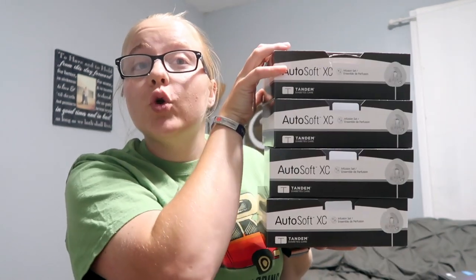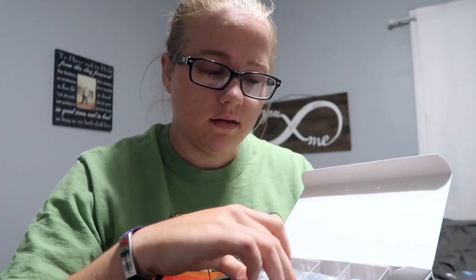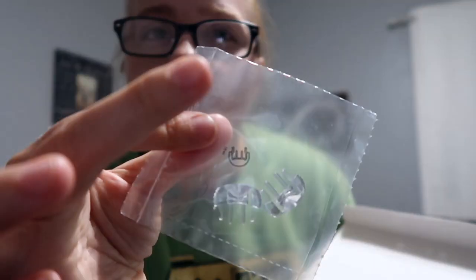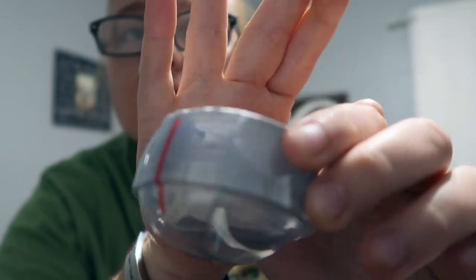This is how many infusion sets you get — it's four boxes, and each box has ten infusion sets in it. It comes with the little clips that you can put over your site if you are taking a shower or getting in the pool. I chose the Auto Soft XC infusion sets. The only reason I chose these is because I saw a lot of other type ones using them and I just liked everything about them.